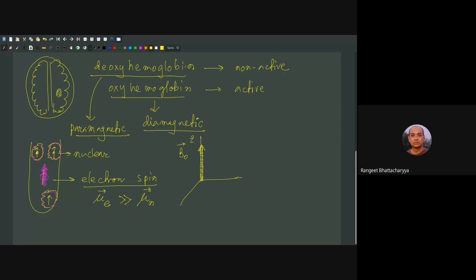Then suppose you apply a 90-degree pulse along the X direction. That too we know what happens. It rotates by 90 degrees, in a kind of anti-clockwise direction about the X-axis, so it will come here. So magnetization will be in the transverse plane. You know that because we mentioned it several times when we were talking about spin echo, that you rotate the magnetization and then you create what you call a coherence.